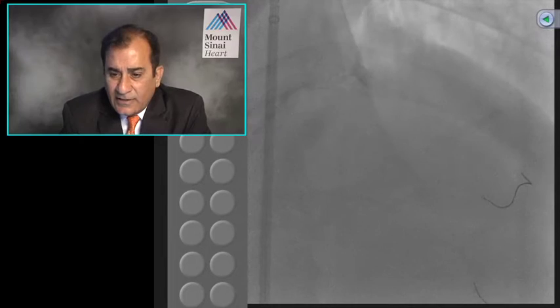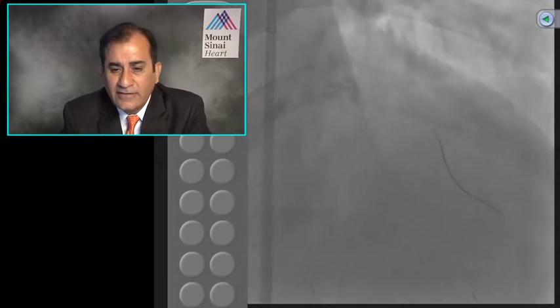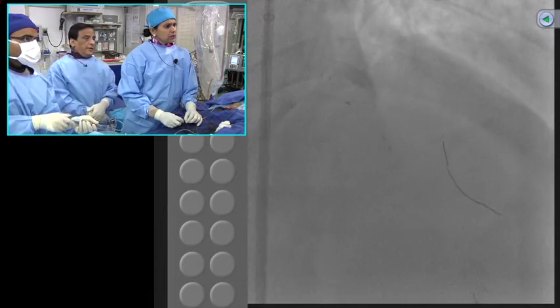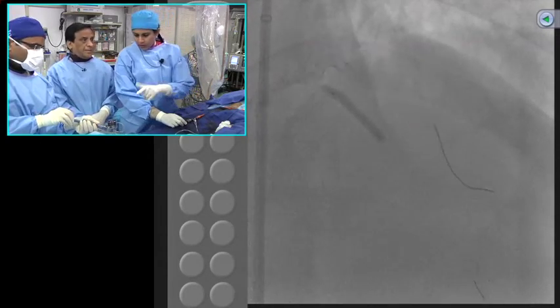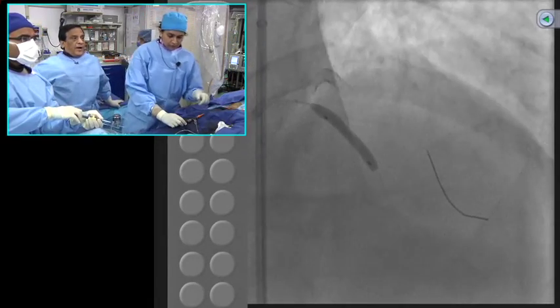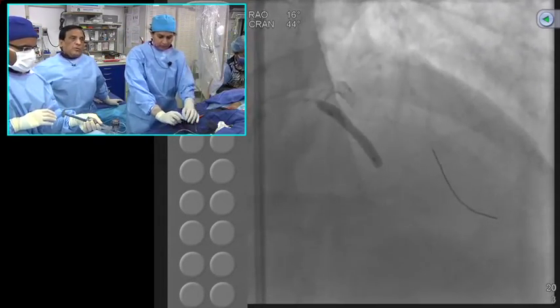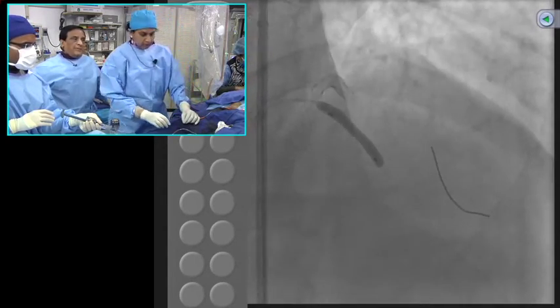Sameen, another question, you've generated a lot of interest today with your talk: is FFR reliable in acute coronary syndromes? Yeah, actually, not in ACS. Although some data are there, even in acute coronary syndrome, we believe that most of the practice-changing data really are from patients with stable syndromes. But I would say, and I want to make it a very clear statement, I think the FFR of the non-culprit vessel in acute coronary syndrome will be true. The culprit vessel may be different, but the non-culprit vessel should be true.